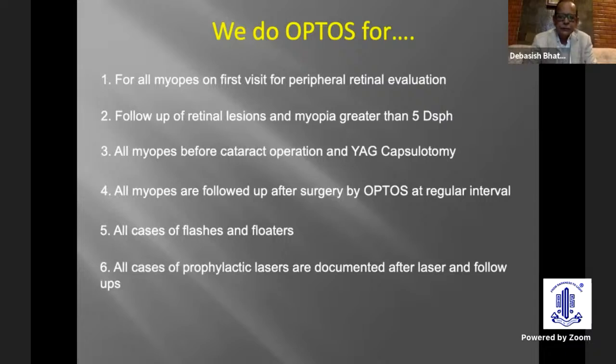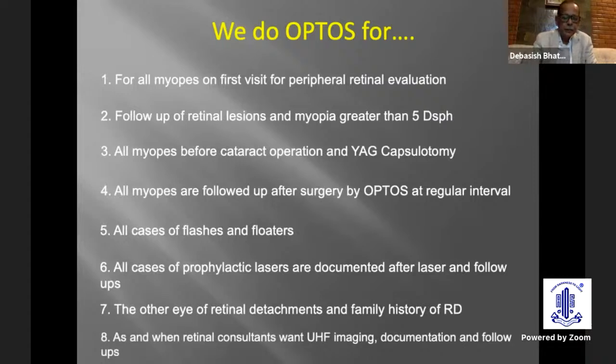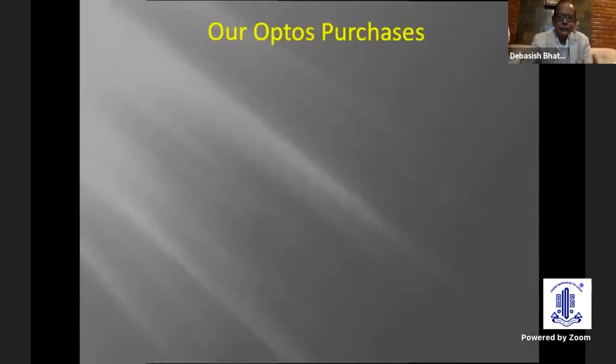And then, of course, as the retinal surgeons decide on prophylactic laser treatments, they are documented, and after laser, they are followed with OPTOS. And of course, the other eye of retinal detachments, family history of retinal detachments, these patients fall under a category where they are frequently followed under the OPTOS screening. And of course, we will be discussing many more modalities where the retina surgeons find it useful, this ultra-wide field imaging. And so that is the entire gamut.